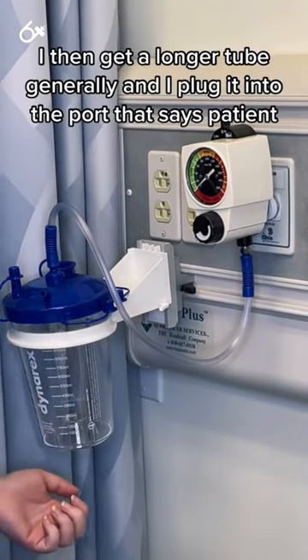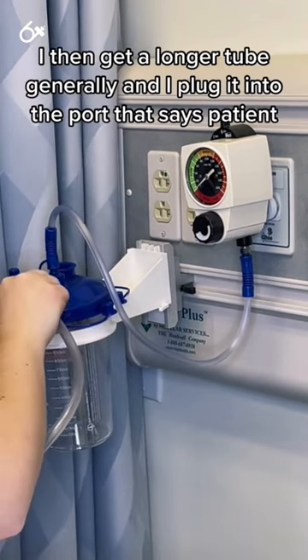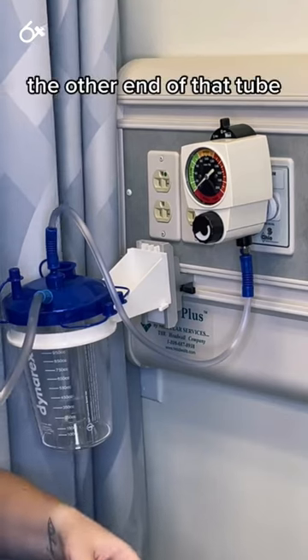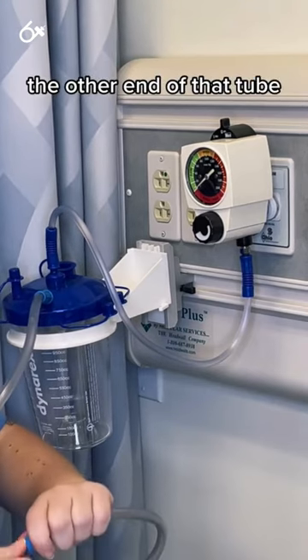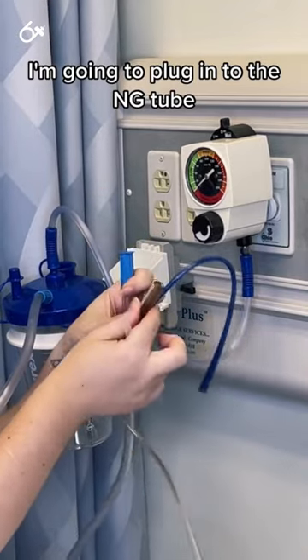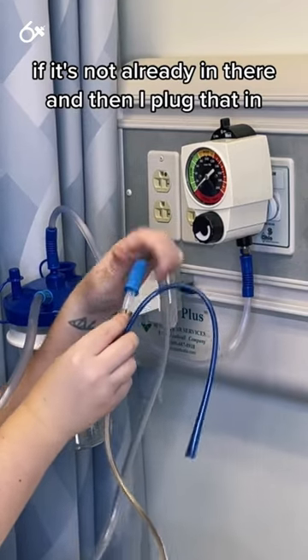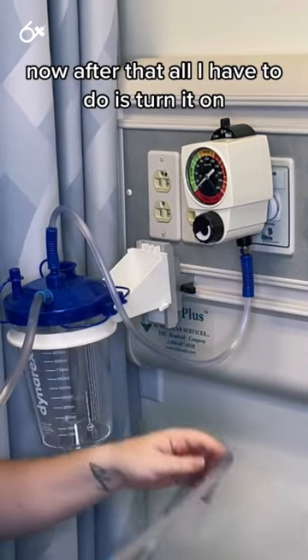I then get a longer tube and plug it into the port that says patient. The other end of that tube I'm going to plug into the NG tube. I need to have this adapter if it's not already in there and then I plug that in. So I'm connected now.